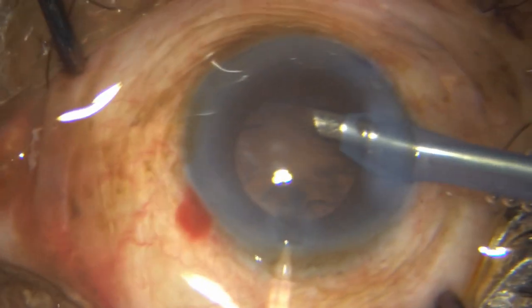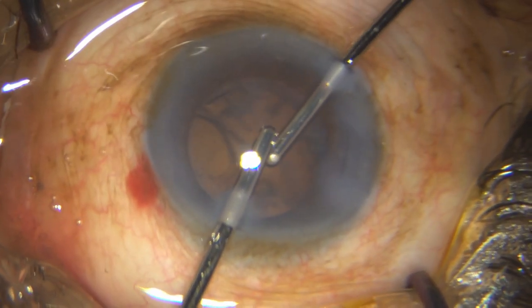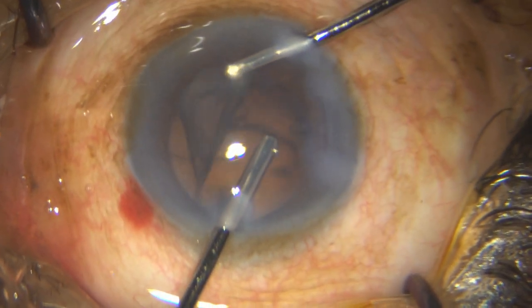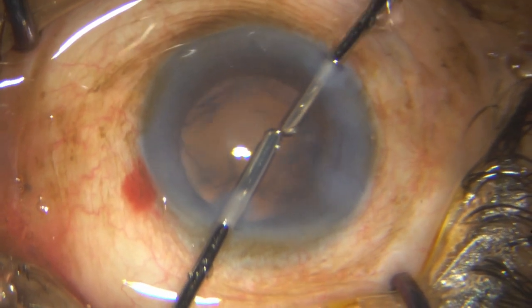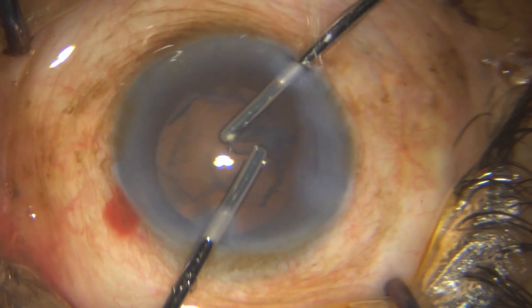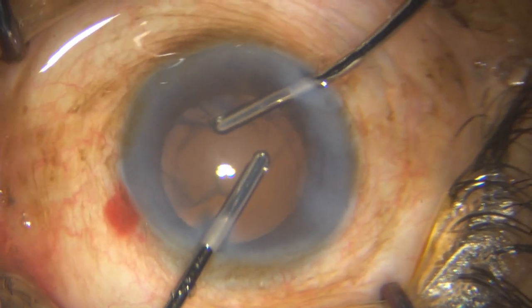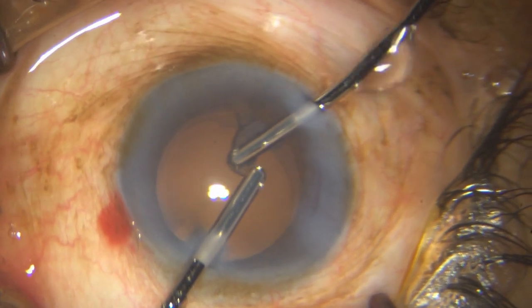Once the whole nucleus is out, I go with my bimanual to remove all the cortical fibers. You have to be a little careful here as well — these cataracts have a tendency to have loose zonules, so don't be too foolhardy when you are doing this step.